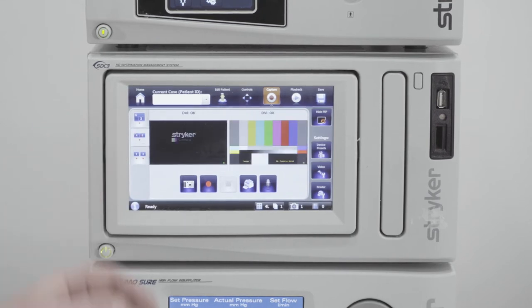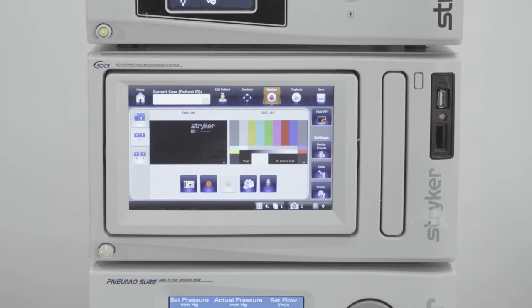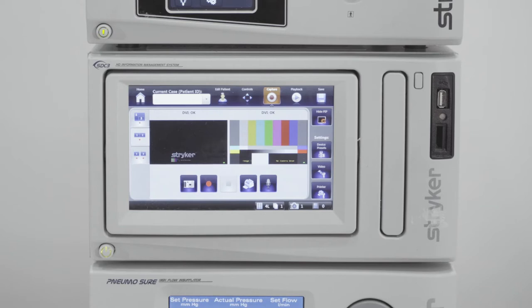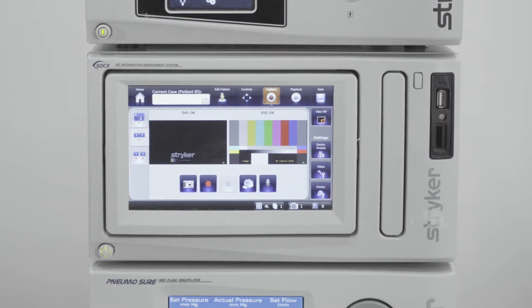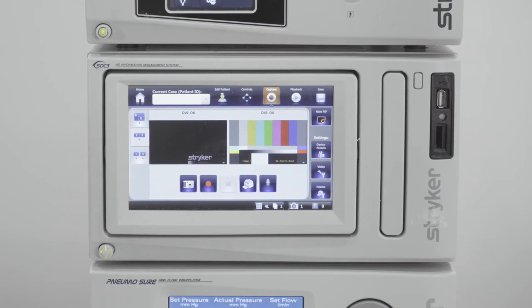The second option is an independent mode with automatic capture — as soon as you take an image on channel one it automatically takes the next image on channel two. You have to be careful with this option because if you don't want an image taken on channel two, you don't want to be in this mode.